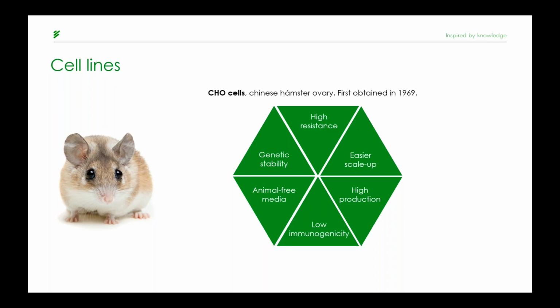There's also a wide range of chemically defined media for this kind of products. There are a lot of alternatives. In the next section, we will talk about the different kinds of culture media. And finally, they have a low mutation rate. They have a high genetic stability. So after multiple divisions and replications, they maintain their genetic code with little variation, with little modification.